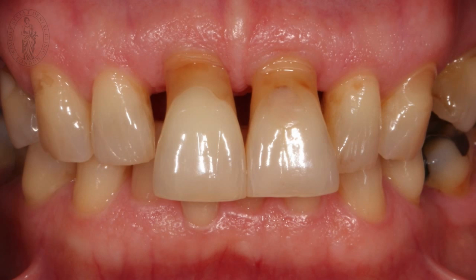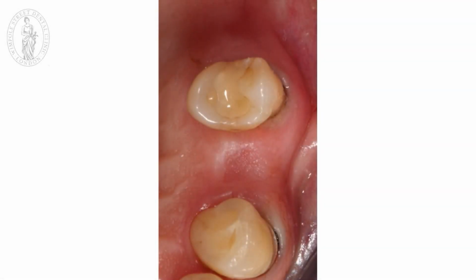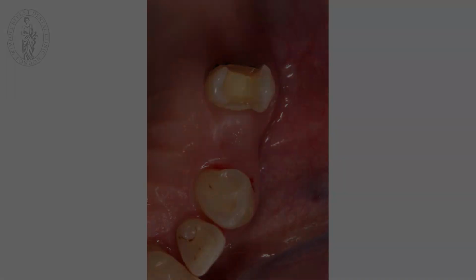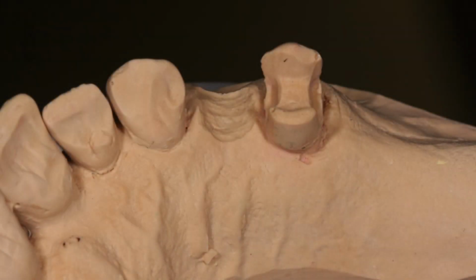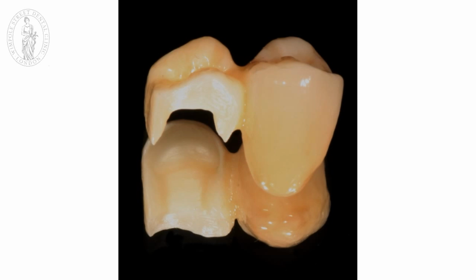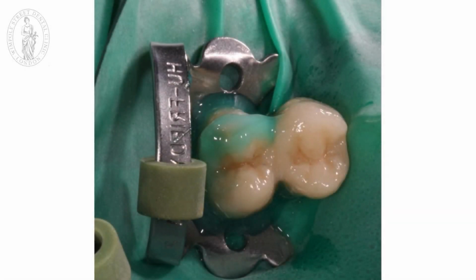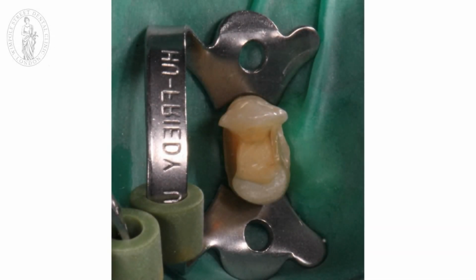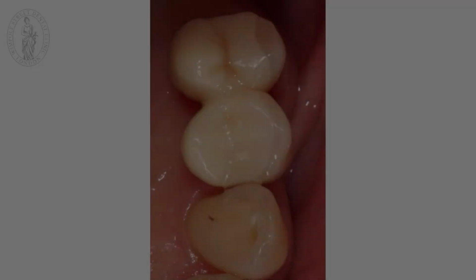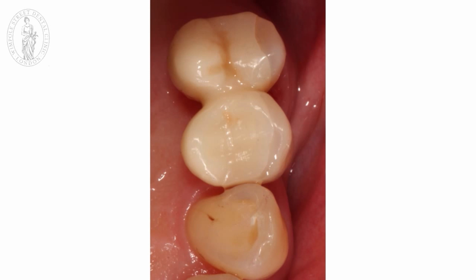So you can see the initial situation on the upper jaw left. That means here on the picture on the right, a tooth is missing, and the patient did not want to have implants or surgery or anything. So we took the color, prepared the tooth, took the impression, and prepared the bridge. This is a bridge, of course, made from ceramic, full ceramic, no metal in it. And then we bonded it very carefully with a special adhesive cement again. This is the tooth before, and that's the situation directly on the day of placement. You see, the tooth is perfectly replaced. You can't really see that it's a fake tooth, except when you look from on top, then you see the framework and the veneering.